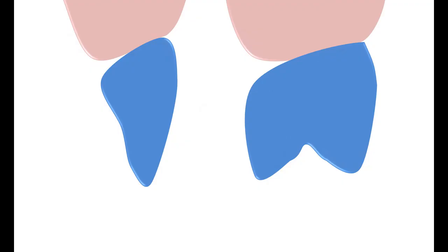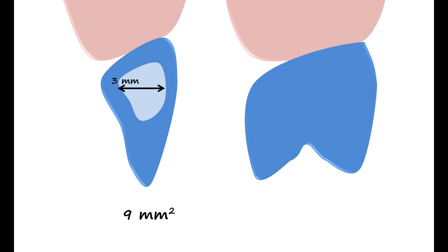For anterior bridges, the connector area between the abutment and the pontic should be 9mm², which means that a 3mm high and a 3mm wide area should be created when designing the restoration.